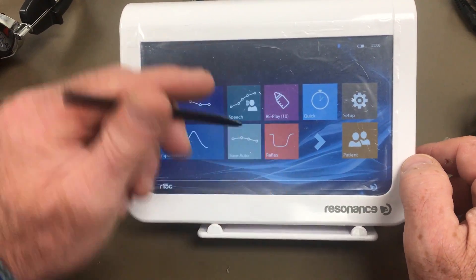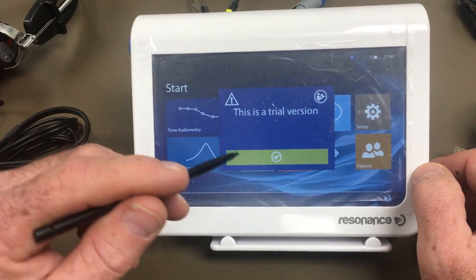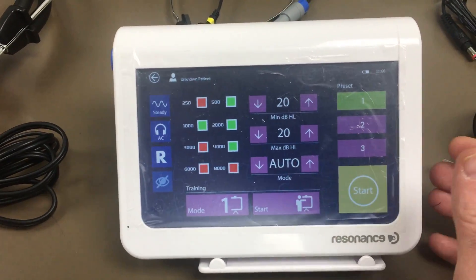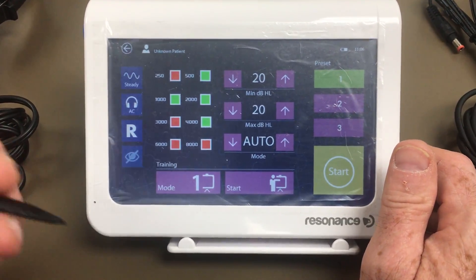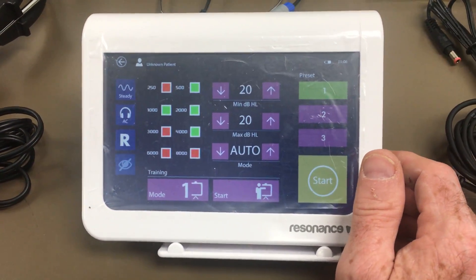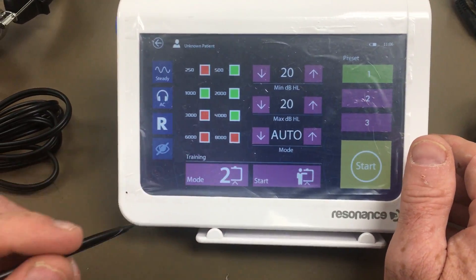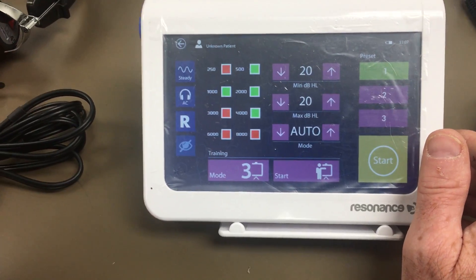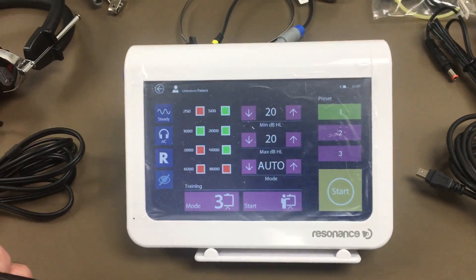Next is the children's replay — currently a trial version. This allows you to help a child assess their hearing. It requires conditioning the child first: you tell them they're going to see an animal playing an instrument for a band. If the child doesn't hear the tone, the animal throws the instrument away; if the child does hear the tone, the animal puts it in a trash can.